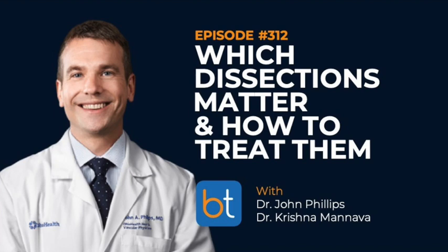It is. A couple of things you have to understand with the TACK system: it's not a stent. There are different sizes. They have kind of an adaptive sizing platform, so to speak. The larger ones are 4 millimeters to 8 millimeters, and they're 8 millimeters in length. Those are great for fem-pop regions. I've been using TACK for a long time, so I've made mistakes with it, and I know where to put it and where not to put it. And we use it off-label for some stuff as well.